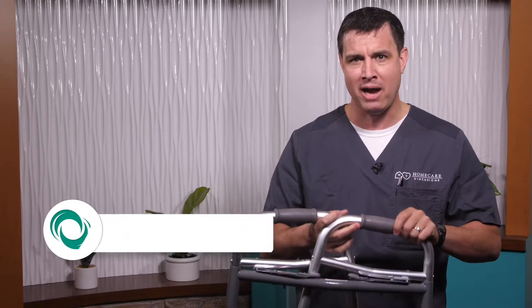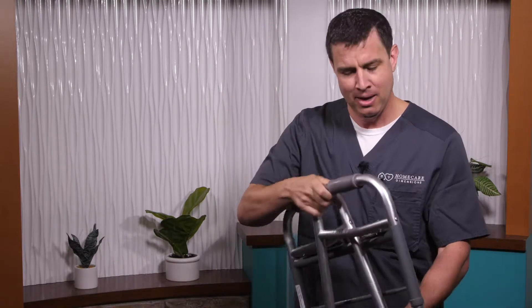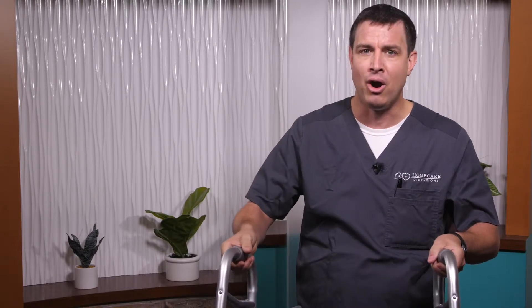The very first thing when your walker arrives to you, it's going to arrive like this — all folded up. So the very first thing you have to do is unfold it: one arm and the second arm. I'm going to place it down in front of me.